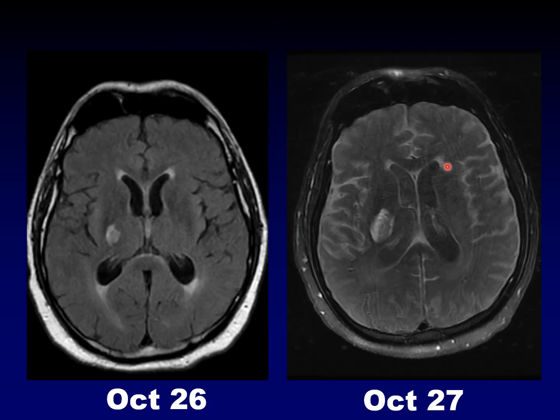Looking again at this diffuse FLAIR signal abnormality — these two studies are one day apart, and that is critical. Theoretically, this patient could have suddenly developed a rip-roaring meningitis, but this would be pretty quick even for listeria. No, this is an artifact of the gadolinium administration that occurred 24 hours earlier. There has been a slow leaching of the gadolinium chelate into the CSF — even from normal meninges, this can occur. This is not indicative of diffuse meningitis.